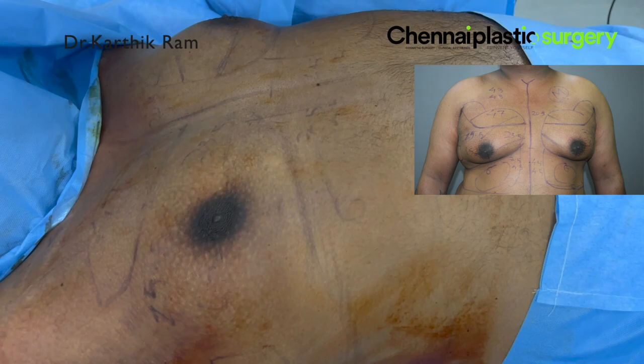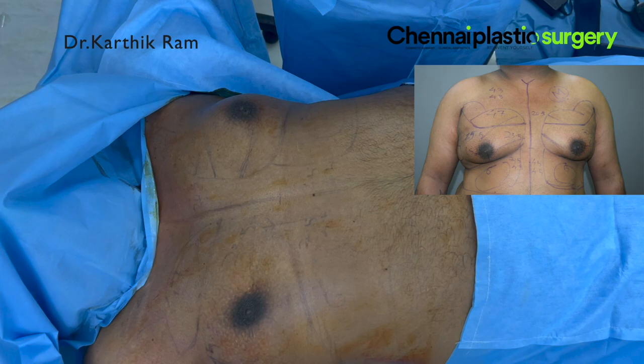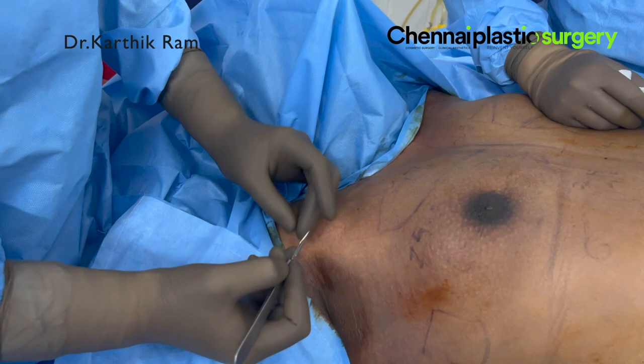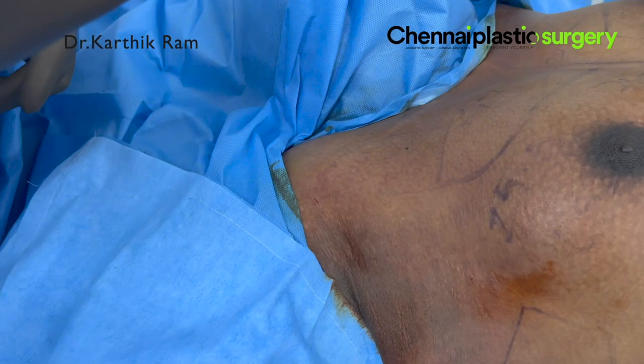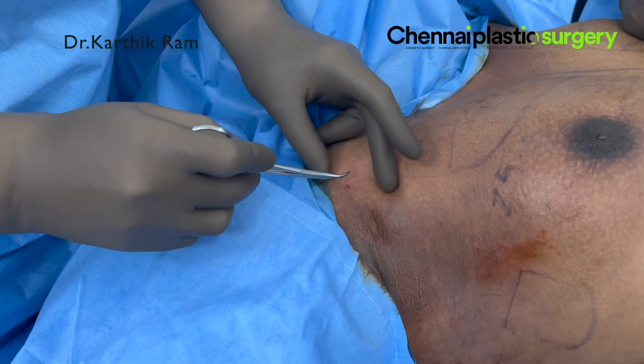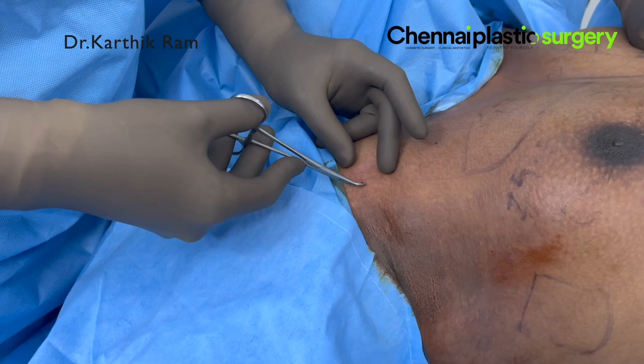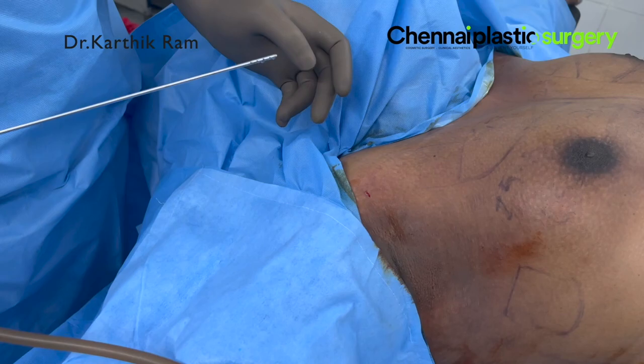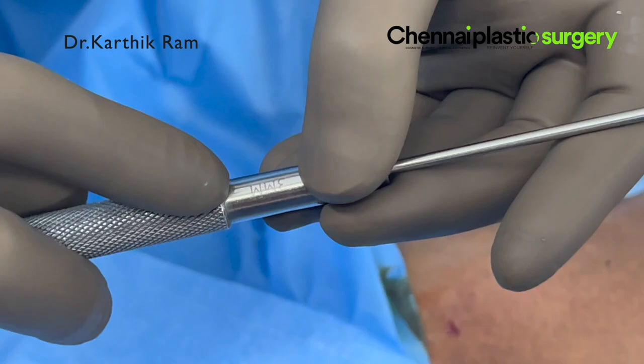When they stand, it looks like a very saggy breast. What we are doing is making a small nick in the armpit region. When you keep the arm by the side, you can see a small fold formed there. We mark the fold preoperatively. We make a very small cut — maybe a 3 to 4 mm cut — to do our infiltration and liposuction procedures. The incision is made and this is a 3 mm infiltration cannula.